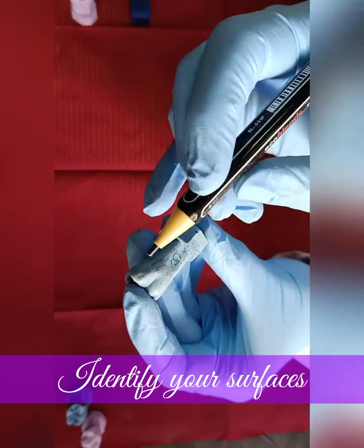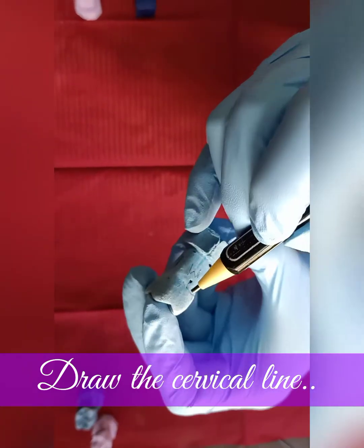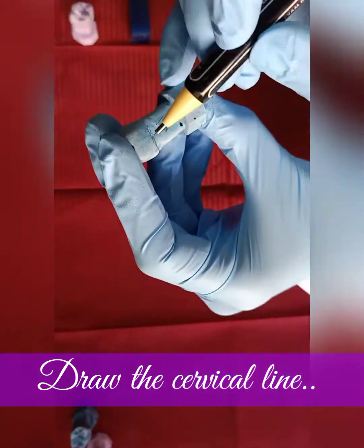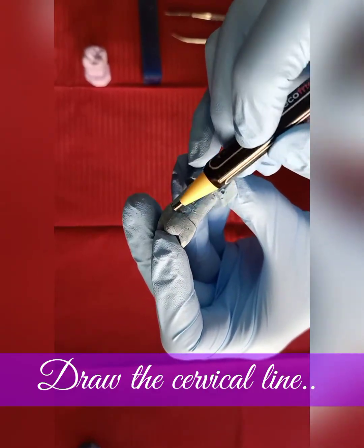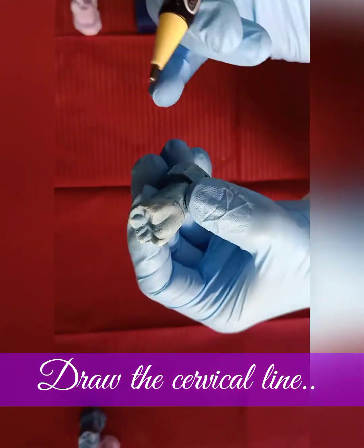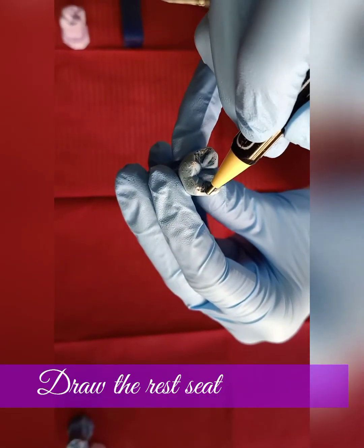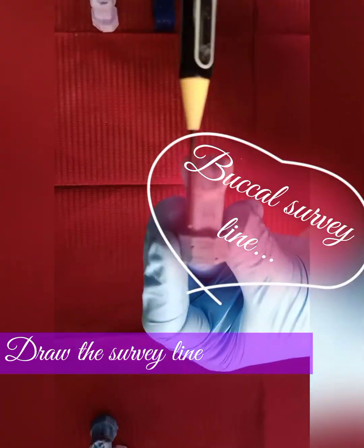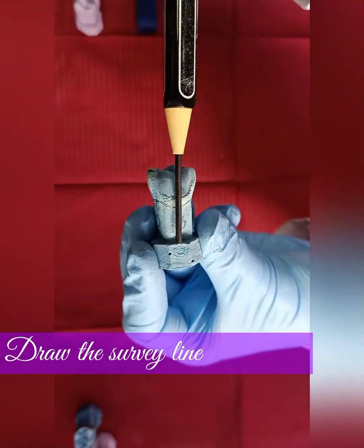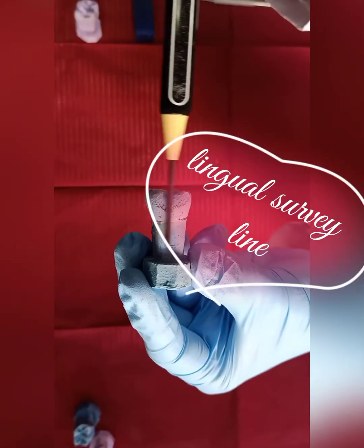Identify all your surfaces, the buccal, lingual, mesial and distal surfaces. Then draw your cervical line. The ring clasp has two occlusal rests, one on the mesial and the other on the distal. Start drawing the buccal survey line and the lingual survey line to define your undercut area.